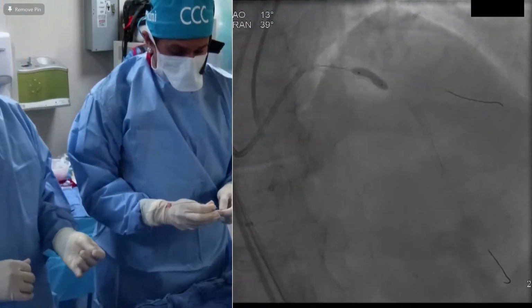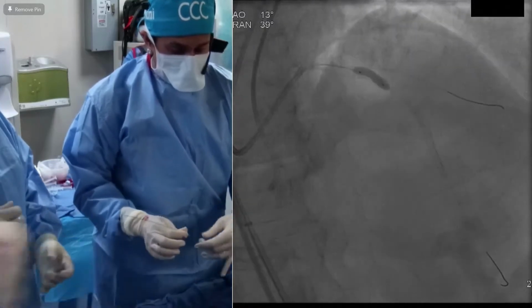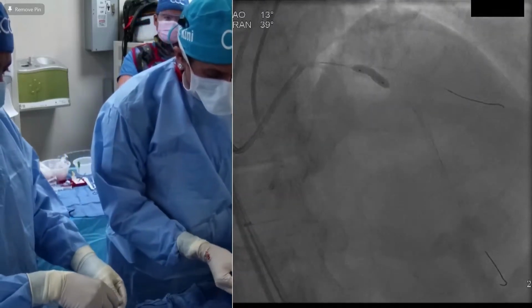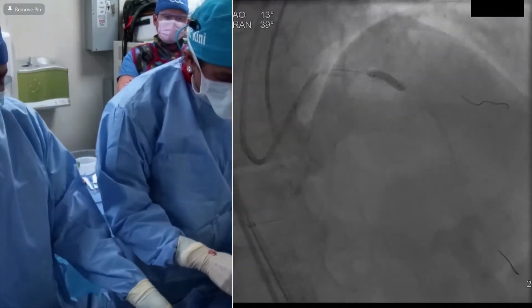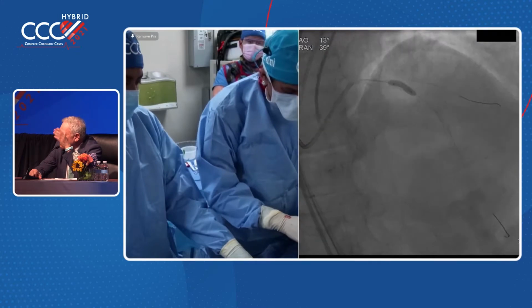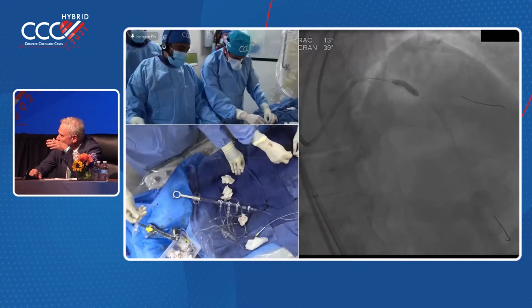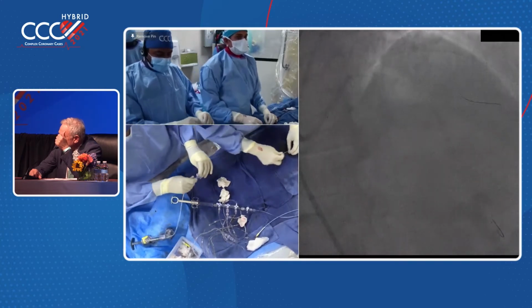Dr. Waxman has a comment. No, I think the app is right. Look how many procedures you have to do, and you still may have to put another stent. So you're doing cutting balloon 1, cutting balloon 2, then you put the stent, and you have to do post-dilation. Isn't it simpler to go directly with a 2-stent approach? Yeah, well, when you have an ostial diagonal, a big diagonal, this one is maybe more than 2.5.